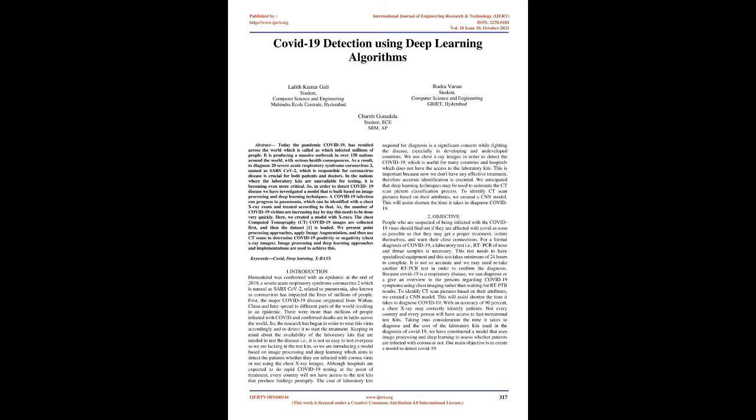Although hospitals are expected to do rapid COVID-19 testing at the point of treatment, every country will not have access to the test kits that produce findings promptly. The cost of laboratory kits required for diagnosis is a significant concern while fighting the disease, especially in developing and undeveloped countries. We use chest X-ray images in order to detect the COVID-19, which is useful for many countries and hospitals which do not have access to the laboratory kits.